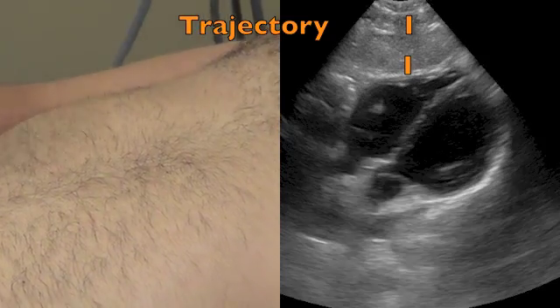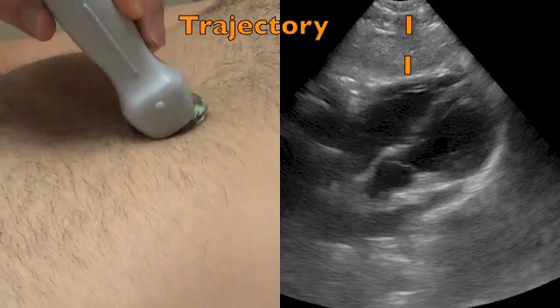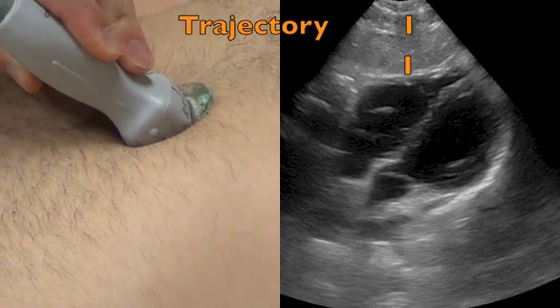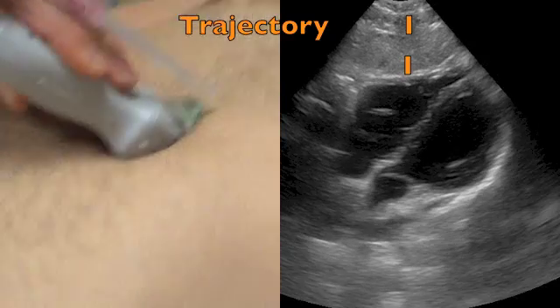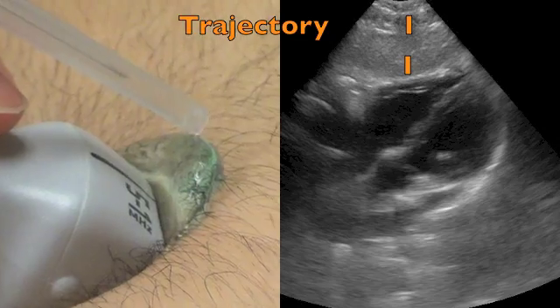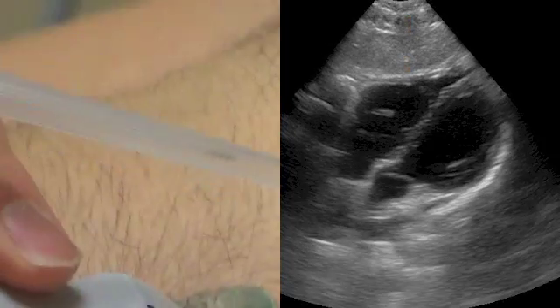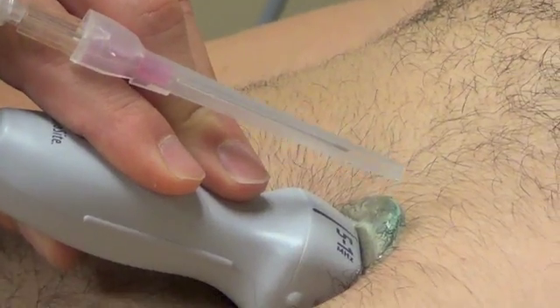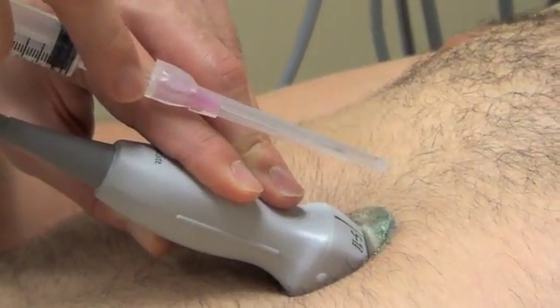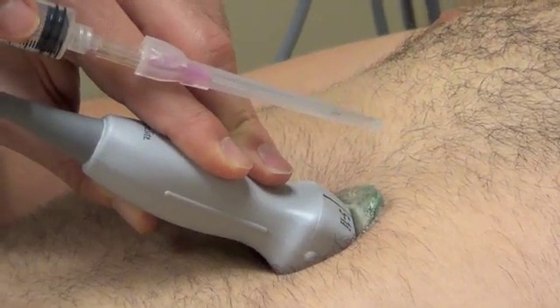Using your ultrasound, I'm going to show you the subcostal view. You want to identify the structures with the ultrasound, then use your needle to go into the skin. Similar to a central line, you'll use the ultrasound to find the needle going into the pericardial effusion. Once you're in, aspirate back on the plunger. Once you have fluid, you can thread the catheter in — that way the needle is not sticking in and you're not going to puncture the heart — and then you'll pull out the fluid.